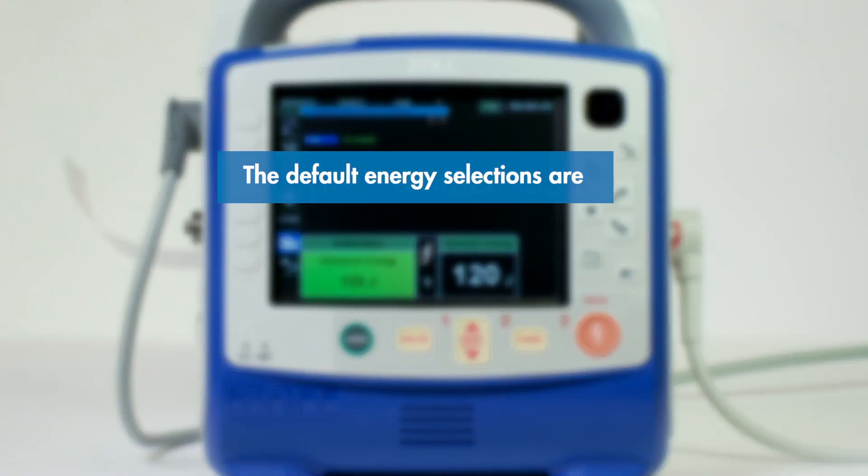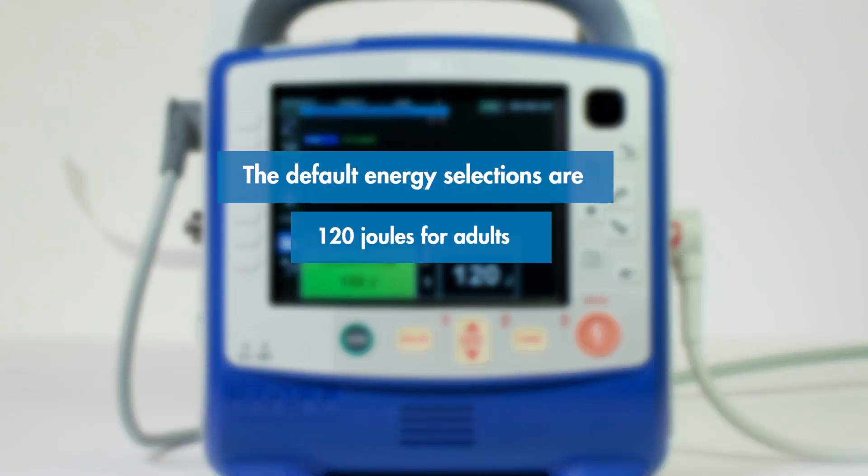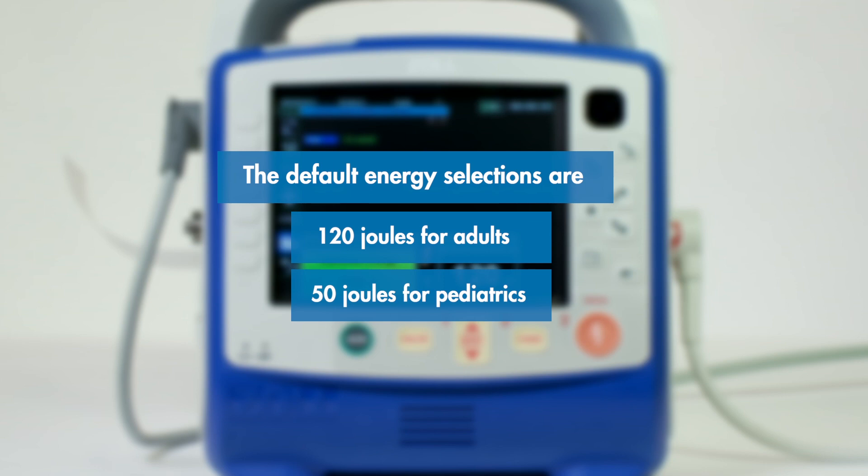The default energy selections are 120 joules for adults, 50 joules for pediatrics, and 50 joules for neonates. If additional counter shocks are needed, repeat these steps.